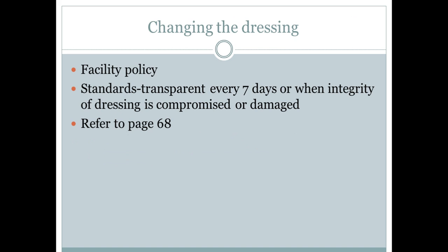Generally, it's every 7 days for a Tegaderm, the transparent covering that you're changing about every 7 days. But again, that might be a little bit different according to facility policy.